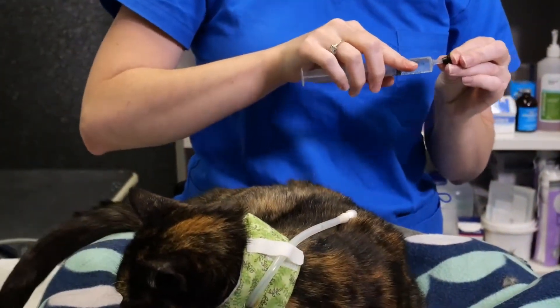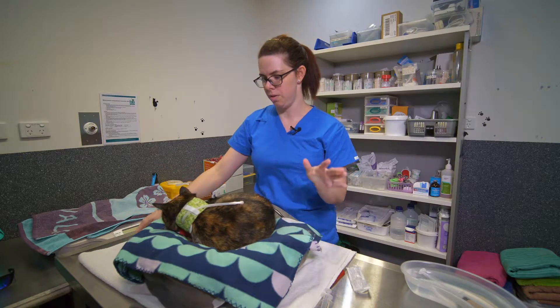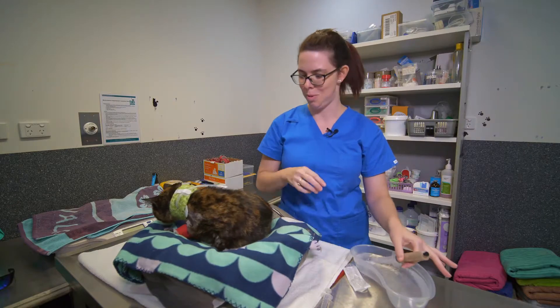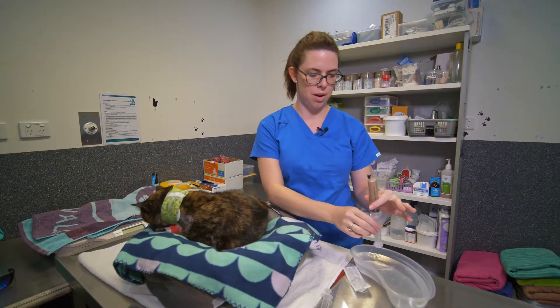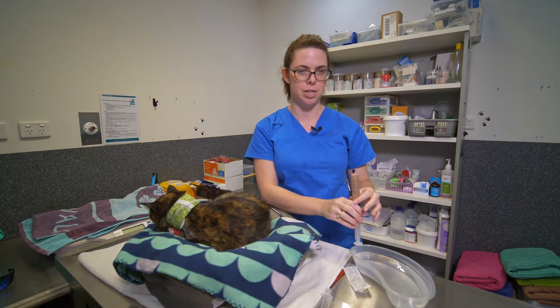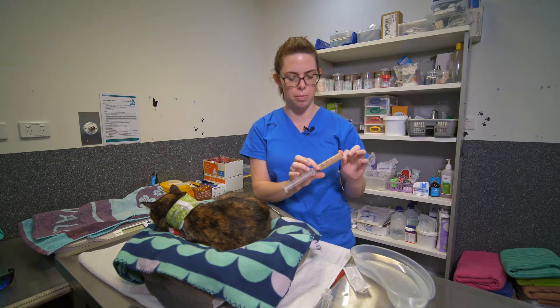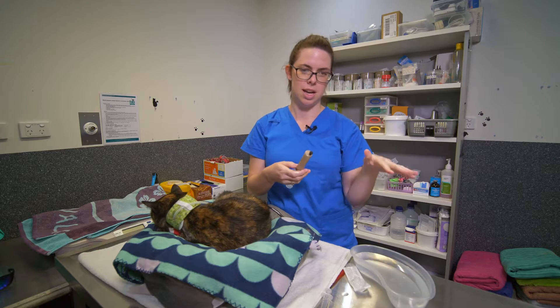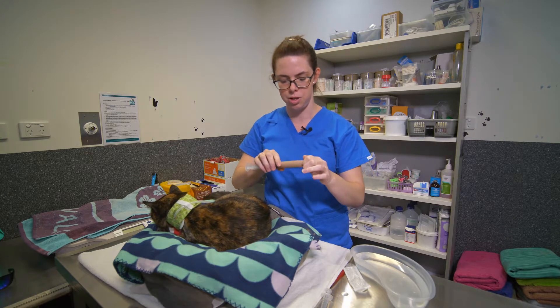You can save the other five mils of water for flushing at the end. For the food mixture prepared earlier — it's been in the fridge, so I've just warmed it up in a warm water bath to room temperature or slightly warmer. This is just a bit more comfortable for when it goes down the tube.